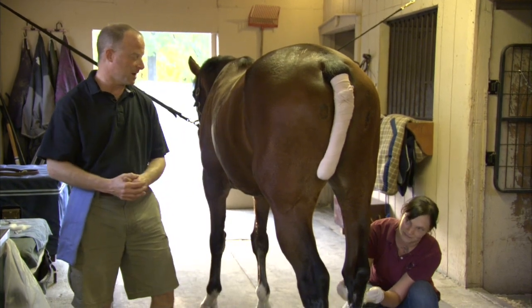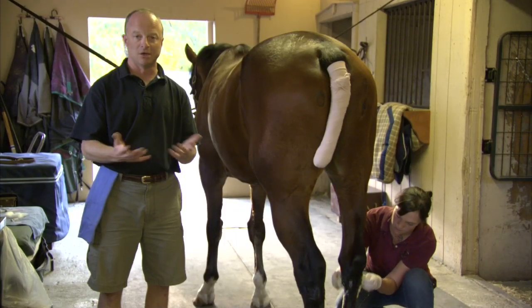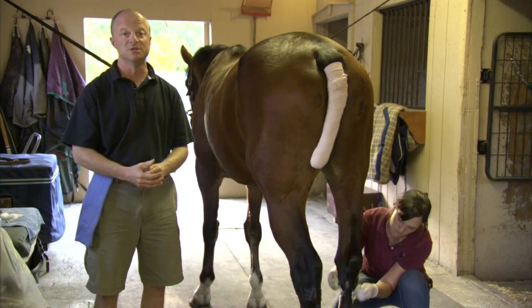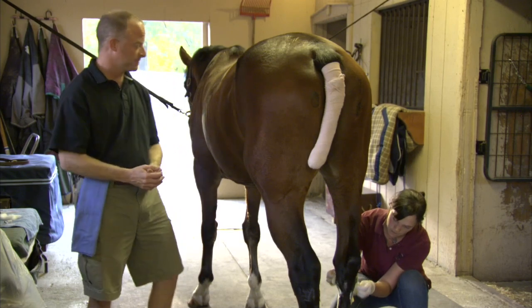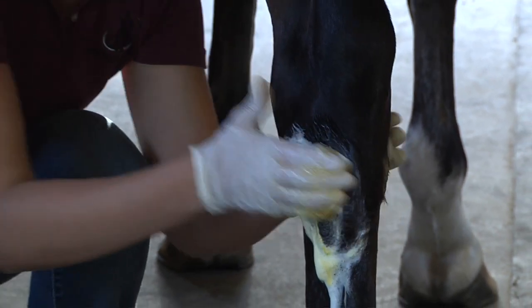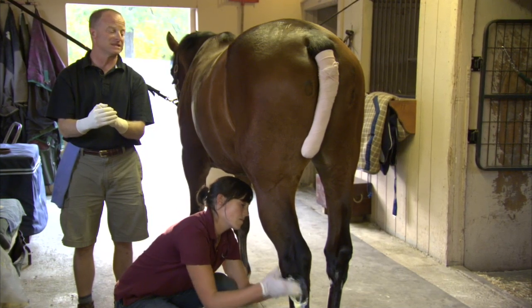My assistant here, Emily, is preparing the joints sterilely and after she is done preparing them, I will put on sterile gloves using sterile technique and I will put needles into the hock joints and inject them with steroids which help to decrease inflammation and make the joint a happier, healthier environment. So Emily is scrubbing the joints with a product called Betadine. It is a sterile surgical soap that we use to clean the area where we need to put the needles in so that it is as clean as possible.